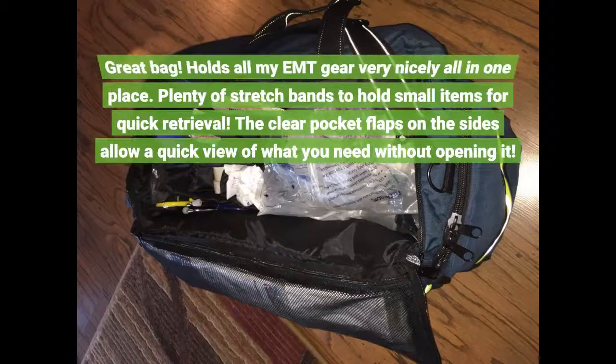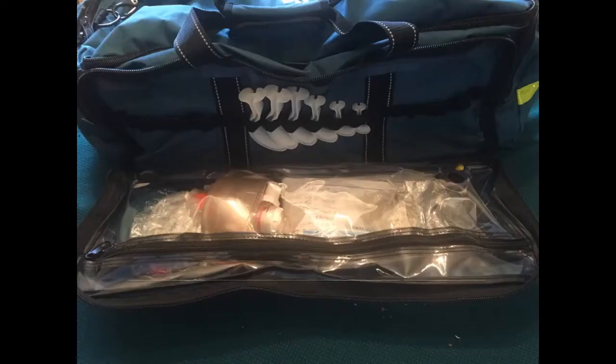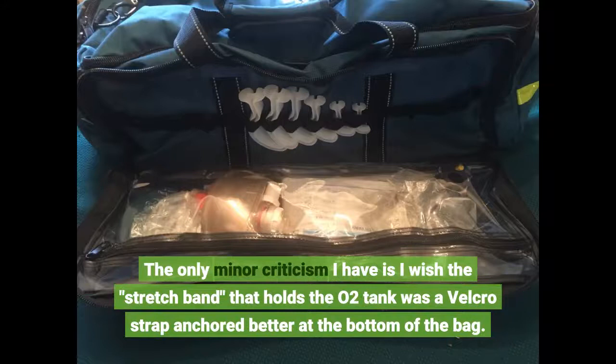Great bag. Holds all my EMT gear very nicely all in one place. Plenty of stretch bands to hold small items for quick retrieval. The clear pocket flaps on the sides allow a quick view of what you need without opening it. The only minor criticism I have is I wish that stretch band that holds the O2 tank was a Velcro strap anchored better at the bottom of the bag.